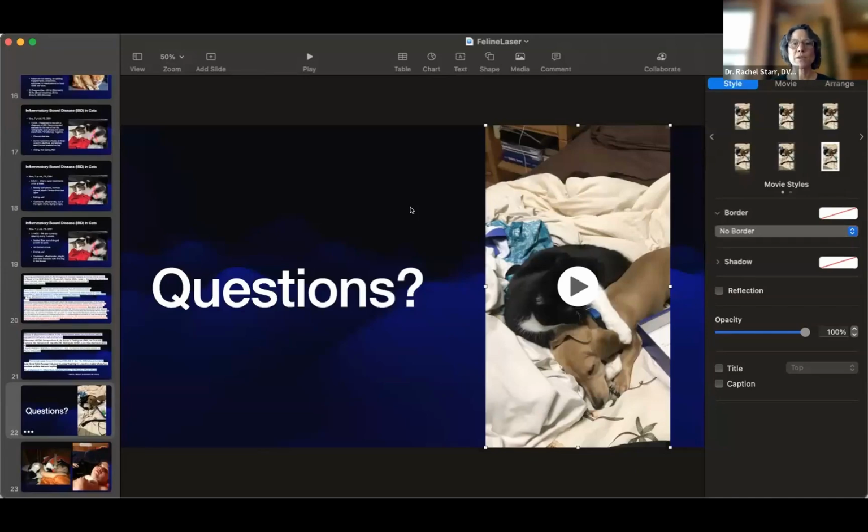Just to clarify, which lasers do I use for dilated cardiomyopathy? I use all 3 colors for dilated cardiomyopathy because, remember, we also have that potential to stimulate stem cells. In dilated cardiomyopathy, we have a potential maybe to regenerate some of those heart cells if we can get stem cells into the heart and get them to differentiate. So green is good for that. But otherwise, if you don't have green as an option, I would use red and violet. Again, with the violet, we're getting into being able to stimulate more of that electron transport chain and generate more ATP.